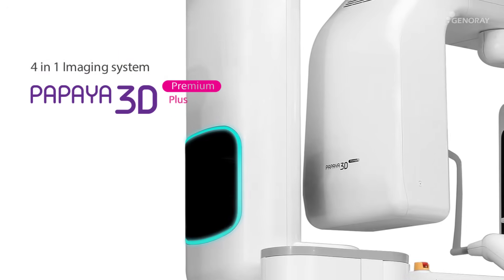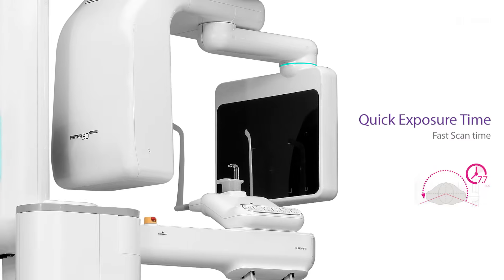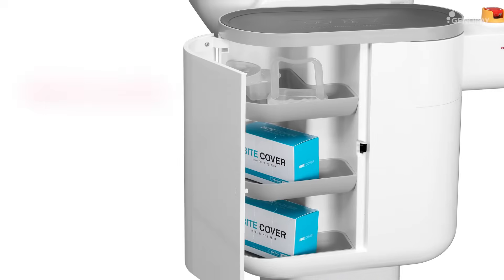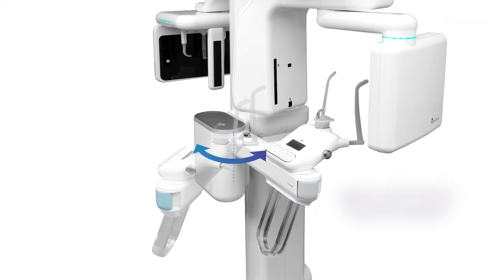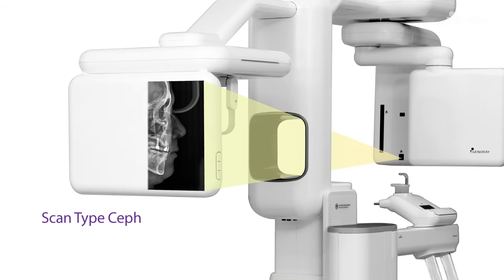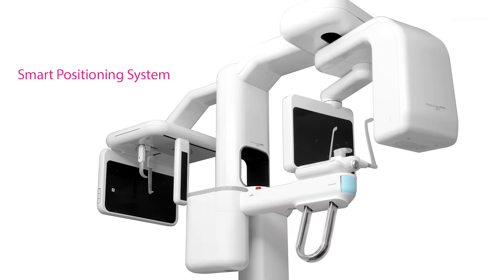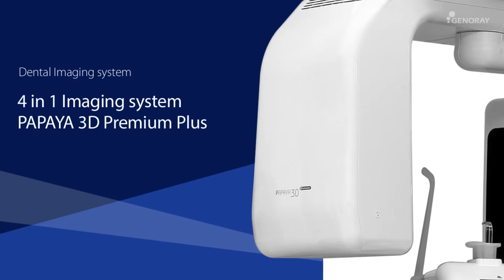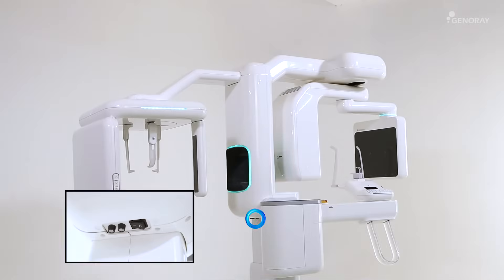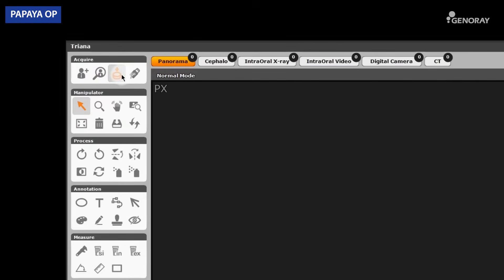This video is for how to use the Papaya 3D Premium, a combination imaging system. To begin with, turn on the power. Register the patient in Triana and click on the Acquire Image icon to initiate the Papaya operation panel.